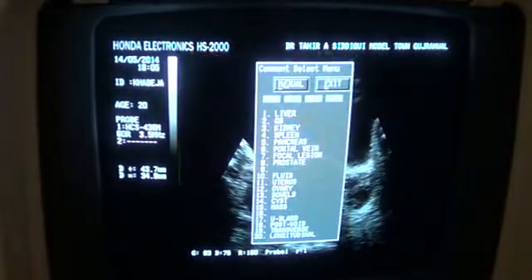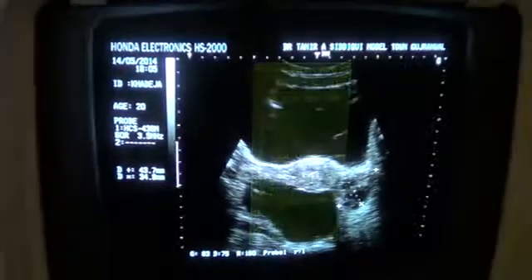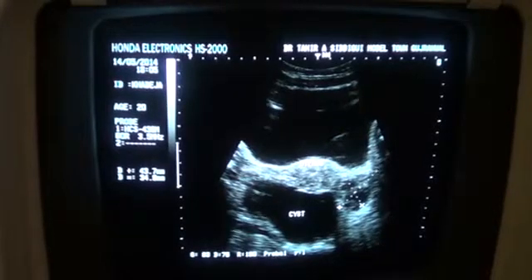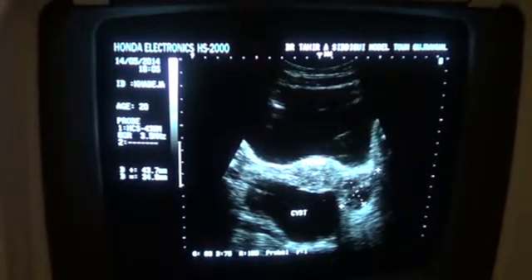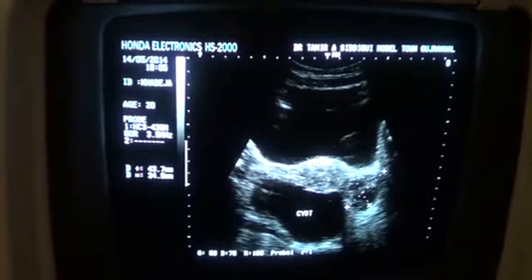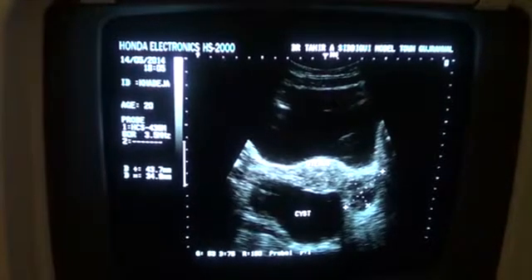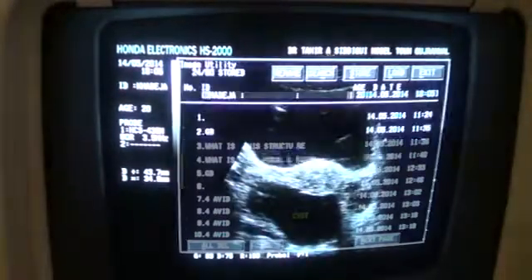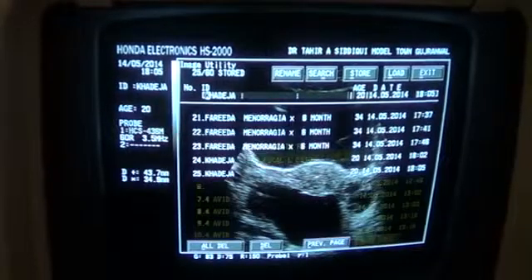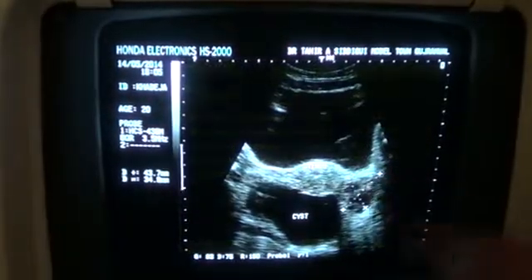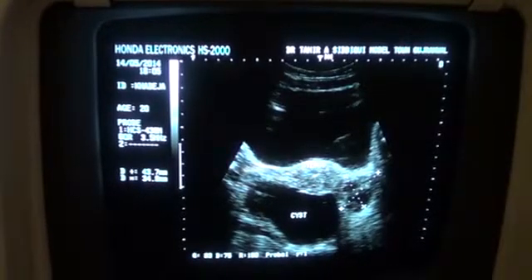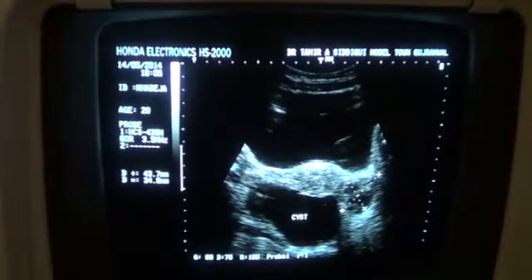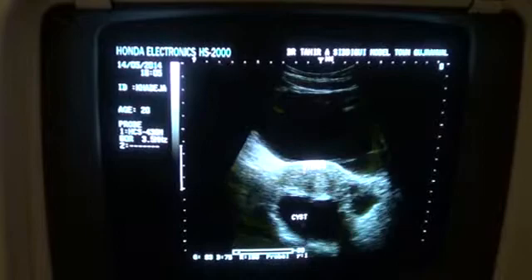And this is the cyst, which in this view is appearing to be absolutely clear of internal echoes or any septas. No calcification and no solid element is seen in this particular view, with disturbed gain settings, just to visualize the ovary properly. Because you continuously play with the gains to get a proper, beautiful view of the image.